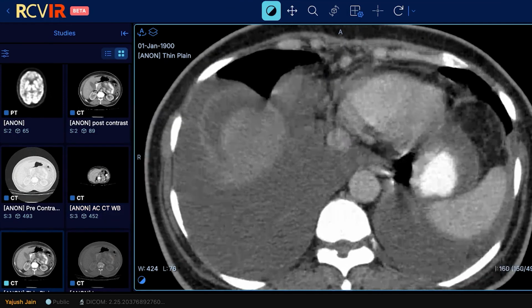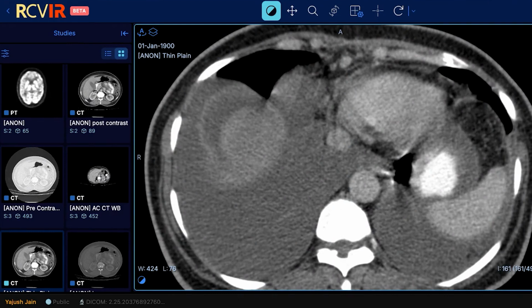which showed that these nodes did have an increased FDG uptake, and now these nodes were selected for a biopsy sampling. So what we did was we targeted this particular lymph node, and we thought that okay, maybe we can take a sample from this particular area and establish the diagnosis. So as you can go and see the supported videos, an ultrasound guided biopsy was done, and to our glad, it came out to be tuberculosis.